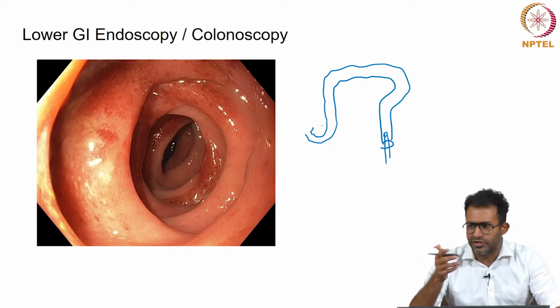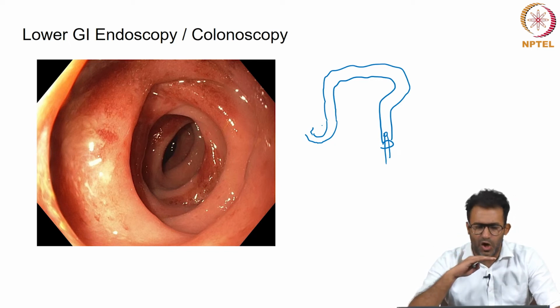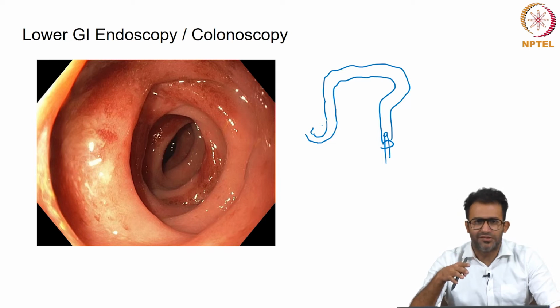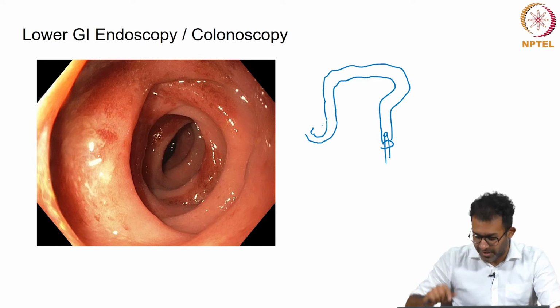Again, it can be diagnostic or therapeutic. Diagnostic colonoscopies are performed on a day-to-day basis. Thousands of them are performed every day in India, and all over the world it's a very common procedure. In most parts of the world, it's a daycare procedure. It can be therapeutic, you can remove small polyps, you can do certain small procedures through colonoscopy as well.